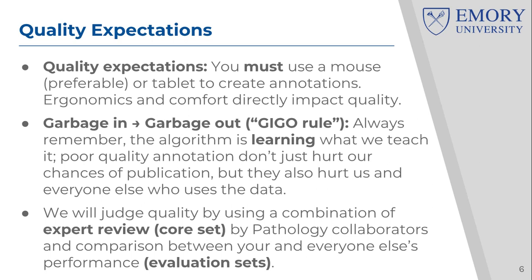So if, for example, you're in a residency program and you don't teach your residents correctly, then of course they're not going to turn out to be great pathologists. So this is the exact same idea, except that computers are a little, or maybe much dumber than human beings are, and therefore there really is not a huge margin of tolerance for poor quality. So please make sure the annotations are of appropriate quality.